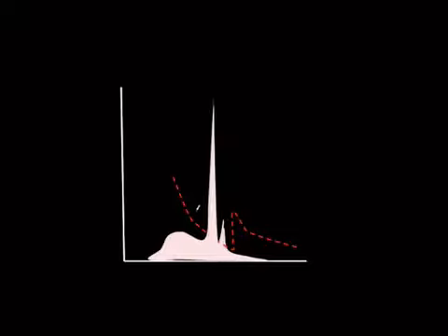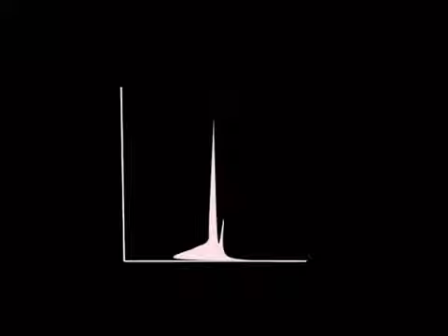The very low energy photons are going to get attenuated and blocked easily. Then we've got our K-edge here, which is going to spike, and what we're going to end up with is a spectrum that changes and looks something like that. So that gives us our maximum. That's the ideal energy, almost this monoenergetic energy, for maximizing our image contrast.